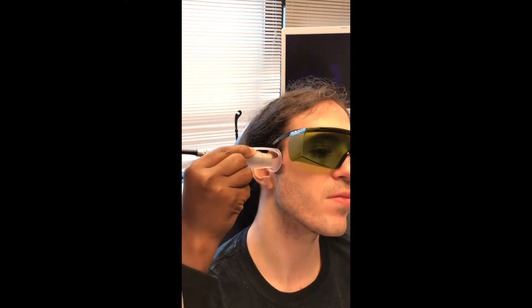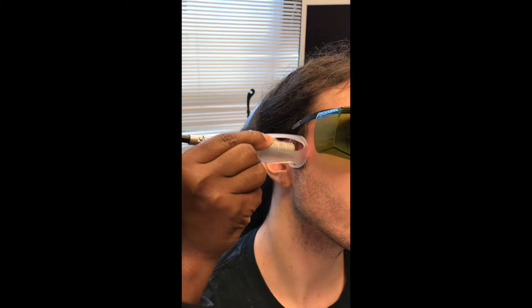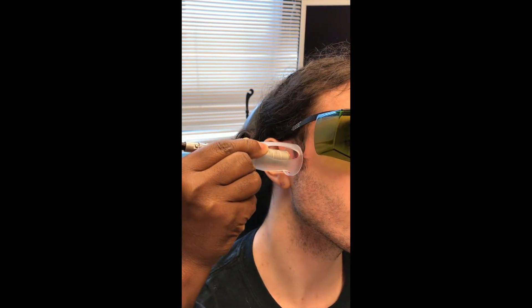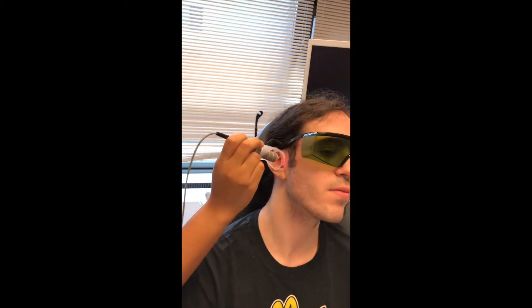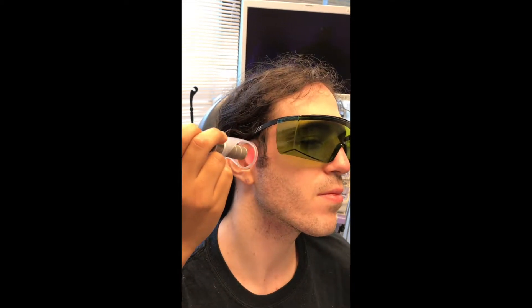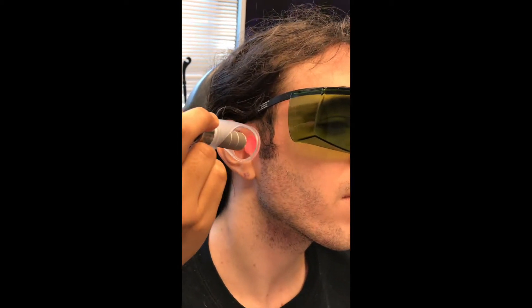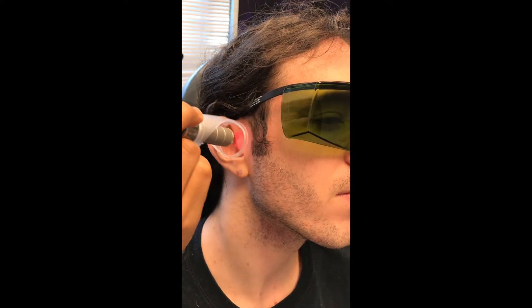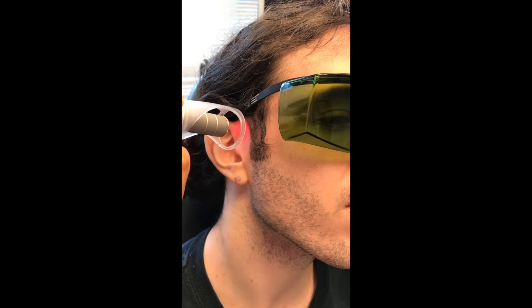You can touch the skin, keep moving up and down, bigger circle, slowly bigger circle. You can be in contact, push the plastic in, keep moving. If you move it, it cools the tissue — seems like it's a hot beam. You can come a bit closer, touch the hair but keep moving.